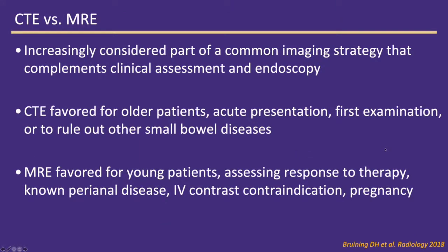The question of when to use CT enterography and when to use MR enterography is one that commonly comes up in our practice. At our institution, most of our gastroenterologists use MR enterography. We have actually very few CT enterographies. That varies by referrer and varies by institution. So depending on where you end up practicing, that trend may reverse. I think in general, they're complementary and roughly equivalent to each other.